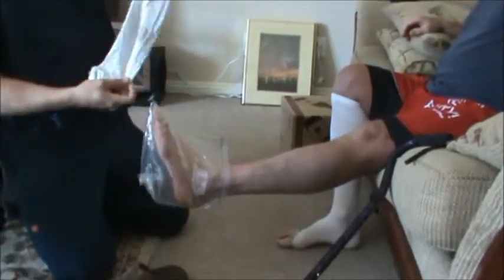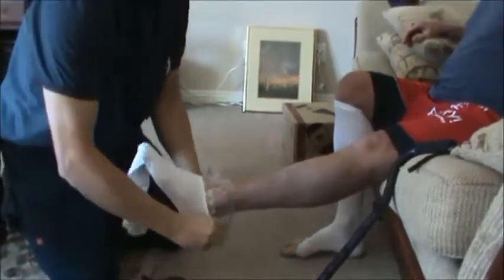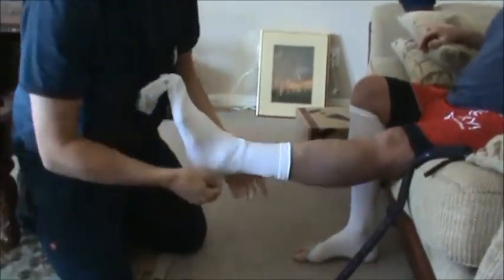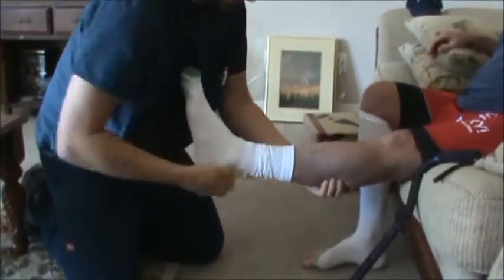A lot bigger on the heel — heel goes down over the foot. To get to the heel, support the leg and pull over the heel.